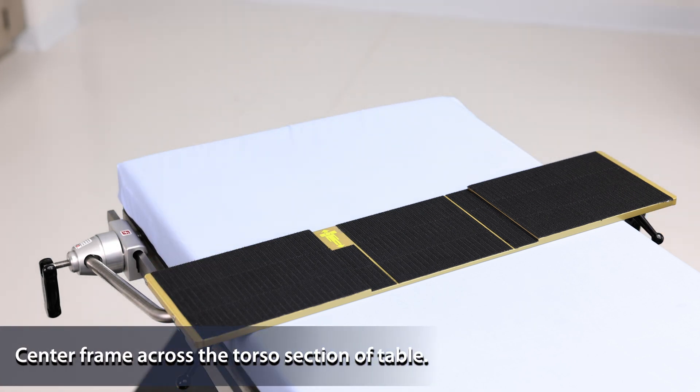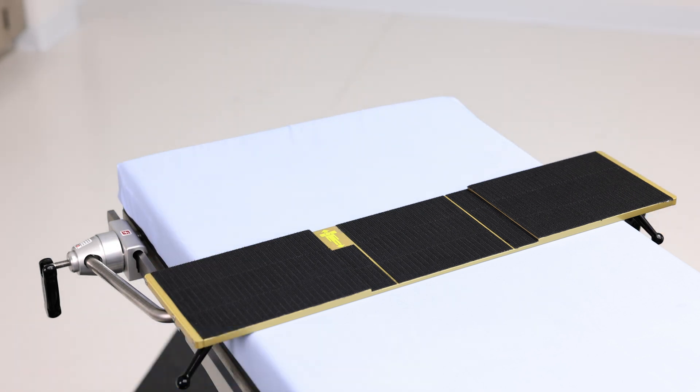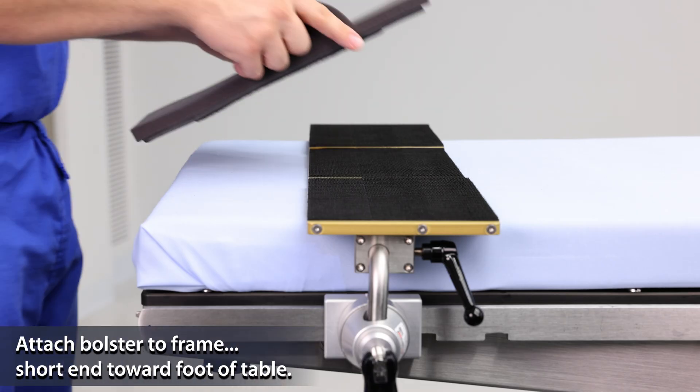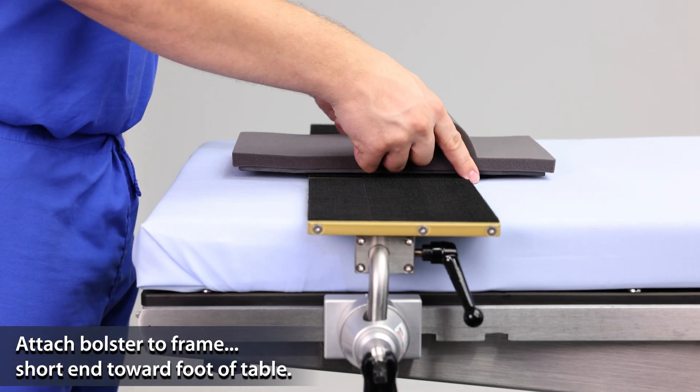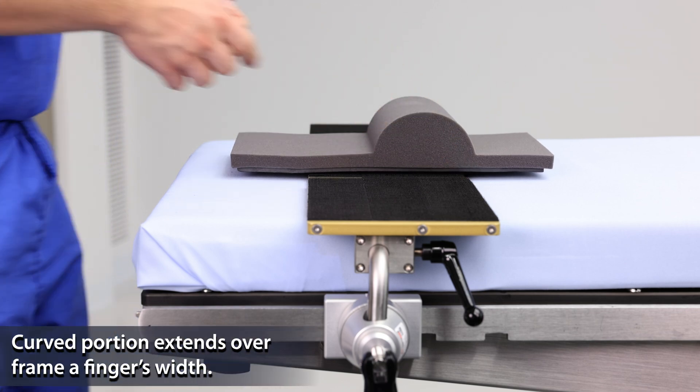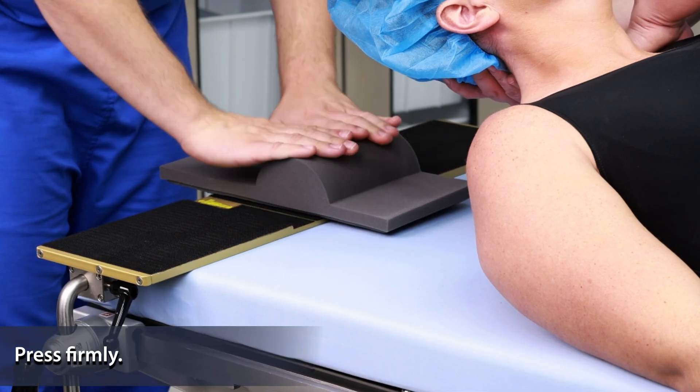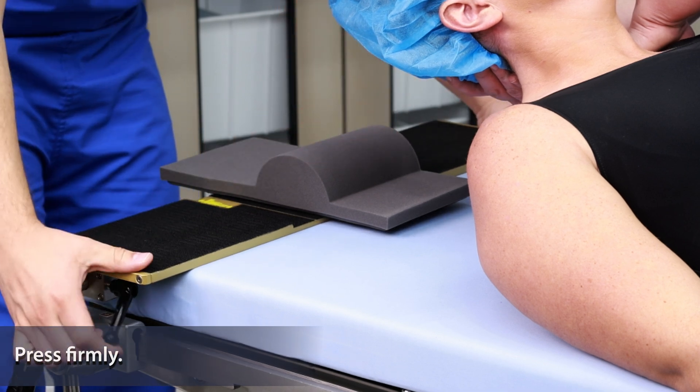Ensure the frame is centered across the table and refer to the label for proper orientation. Attach the cervical notch bolster to the frame. The curved portion of the bolster extends over the frame by a finger's width. Press on the bolster to make a full connection to the frame.